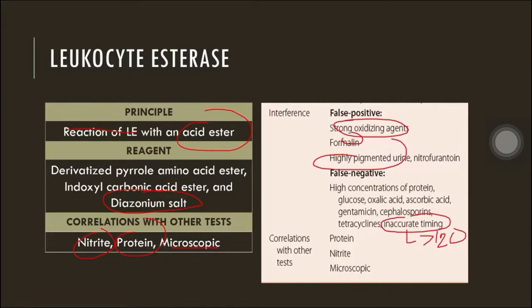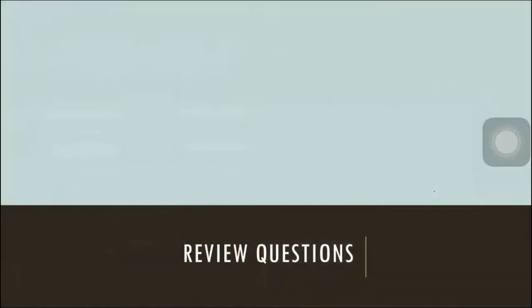Take note again, ascorbic acid, BB lang, di ba? Blood, bilirubin, leukocyte, nitrite, glucose. So we're gonna talk about yung mga review questions nung na-discuss natin, okay, for chemical examination.